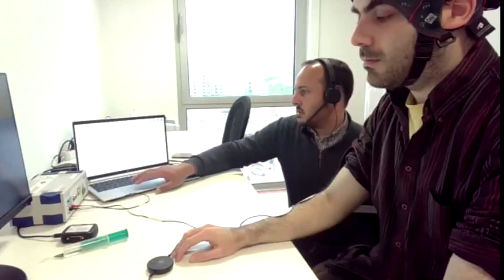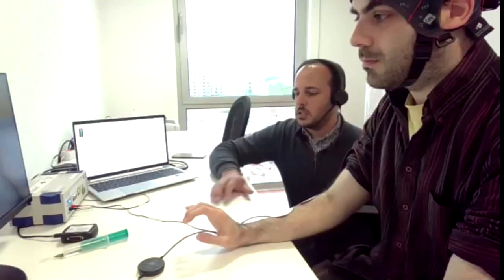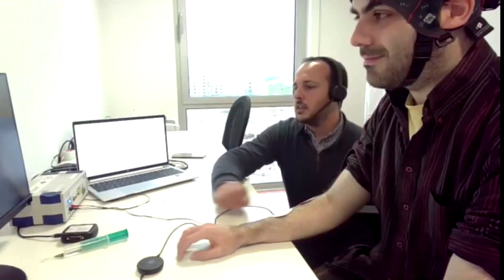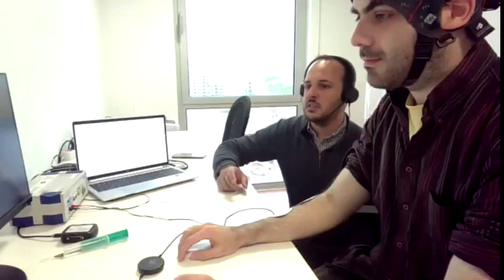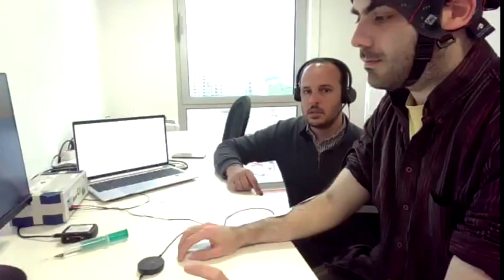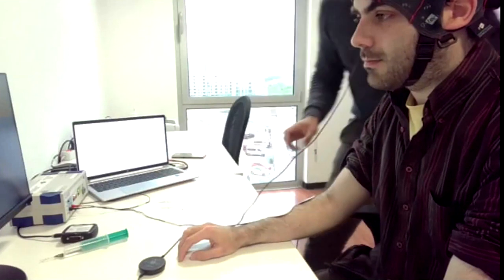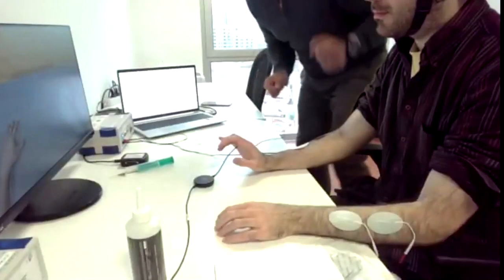Once the signal gets stable, then we can click on the play button, and you can hear the sound. It's in Spanish, his mother tongue. So the system said left, and then the second note, there is a voice that says relax, right? Now again left, and his hands are moving according to that, right?